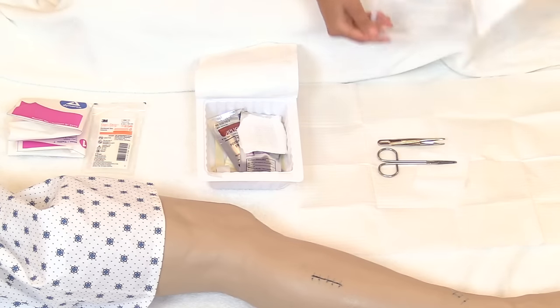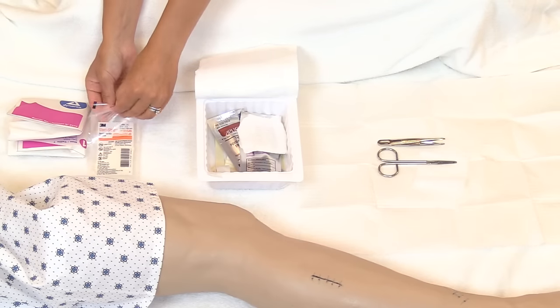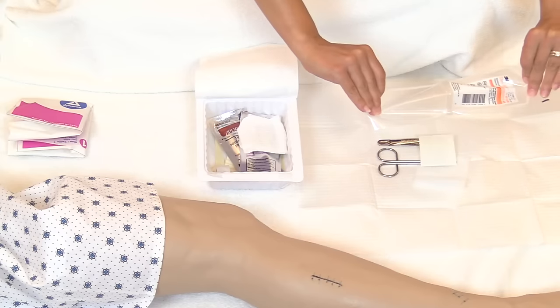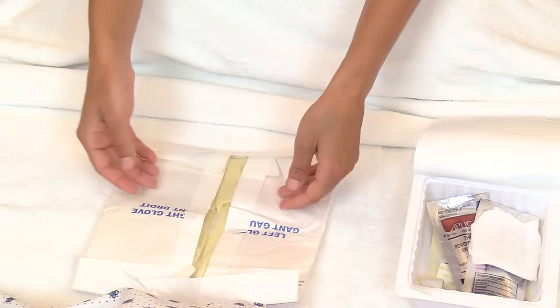Open the suture removal kit and drop it onto the sterile field, then discard the outer packaging. Take the steri-strips and do the same, dropping them onto the sterile field.